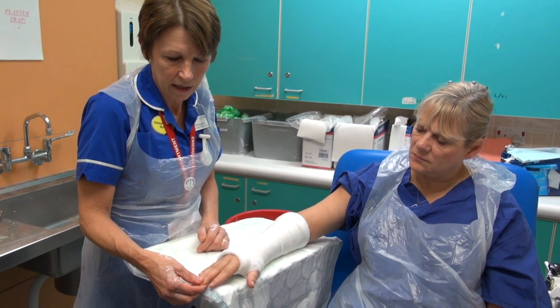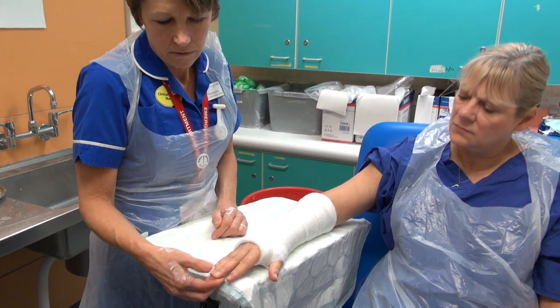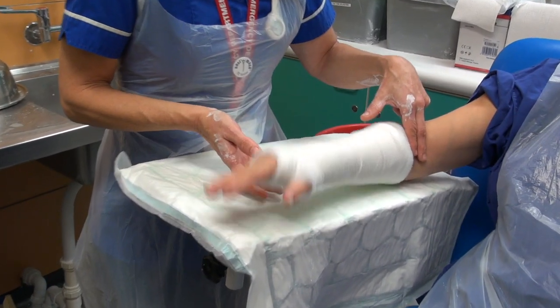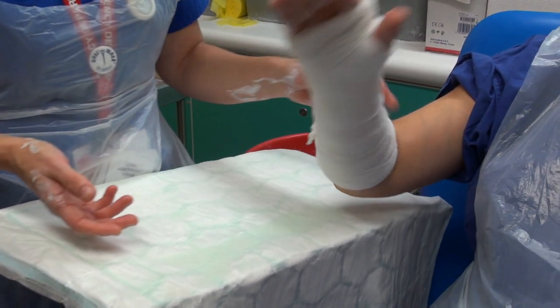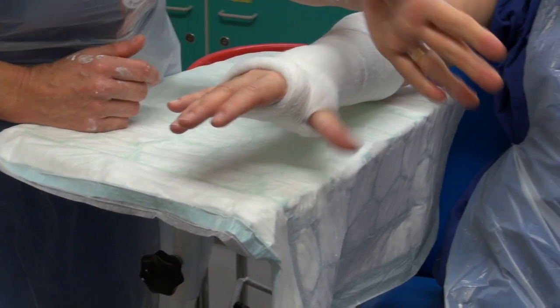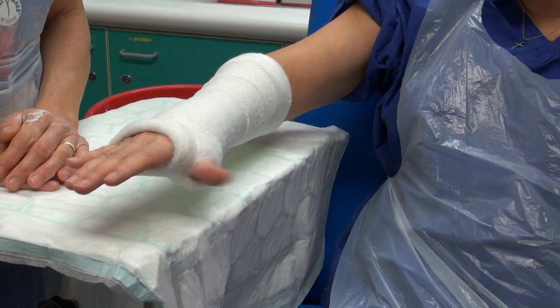So I'm going to hold for five seconds there, then release. The circulation came back there very quickly. Making sure it's not rubbing — so two fingers there, that's fine. The metacarpal heads are free, so you'll be able to move those. You can move your thumb around there — it's not rubbing at all.